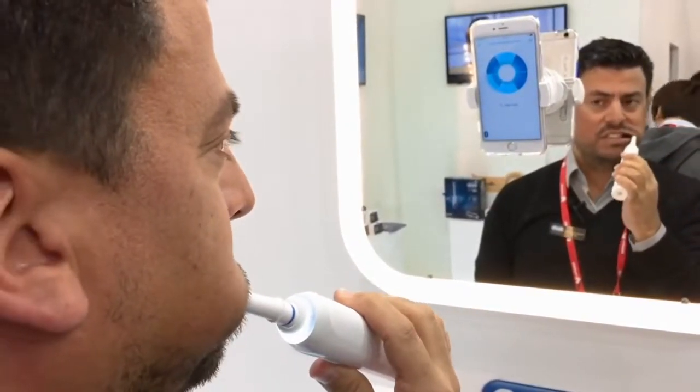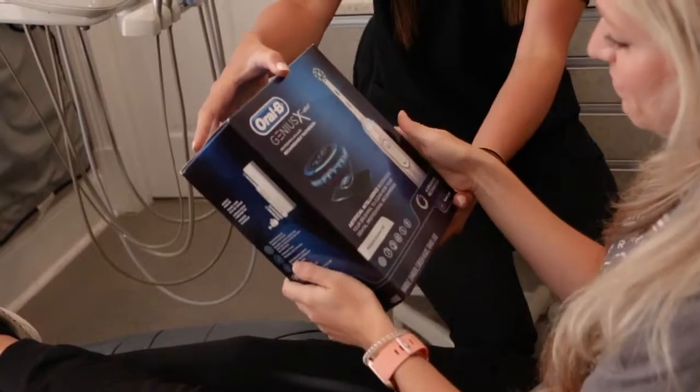I personally love the Oral-B Genius toothbrush. I use it twice a day every day and I have seen a significant difference in my oral hygiene, and also many of my patients who I see back every six months after they purchase the toothbrush — their home care and oral hygiene looks so much better, so I strongly recommend it.